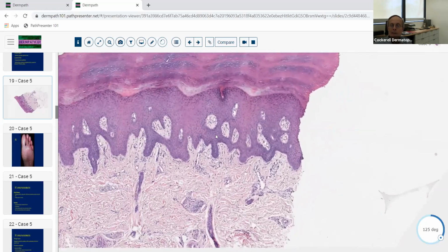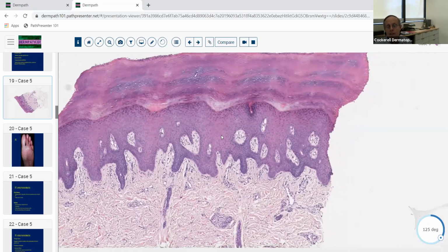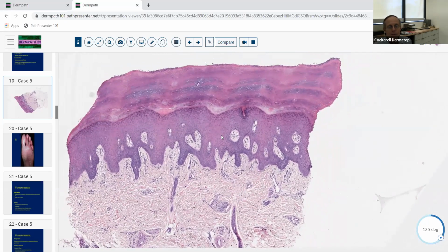So let's go to higher magnification. Is this inflammatory or is it a neoplastic process? Well, certainly it's not neoplastic. We don't see any evidence of neoplastic malformation here. Everything looks pretty much like normal volar skin. The cornified layer is somewhat thick, so you might say, could this patient have a keratoderma, a disorder of cornification? That's a possibility here. But you always want to look in the stratum corneum when you've got something like this to make sure that there's no pathologic abnormality of the stratum corneum.